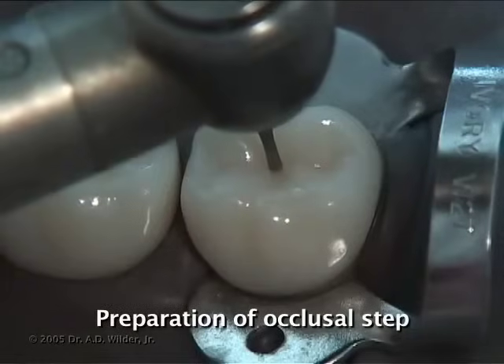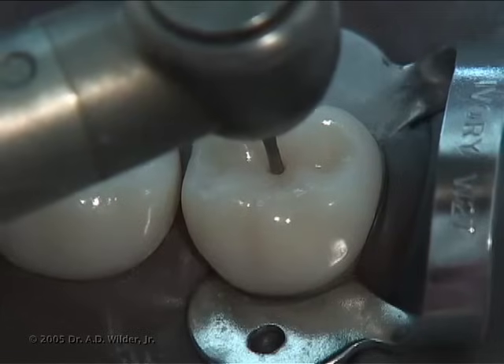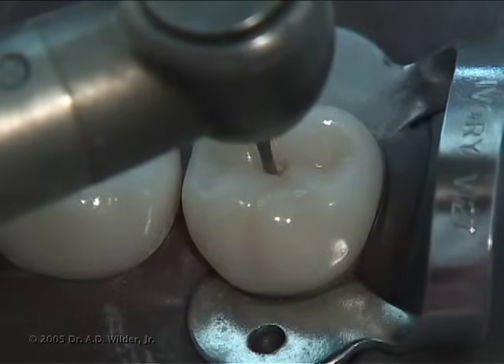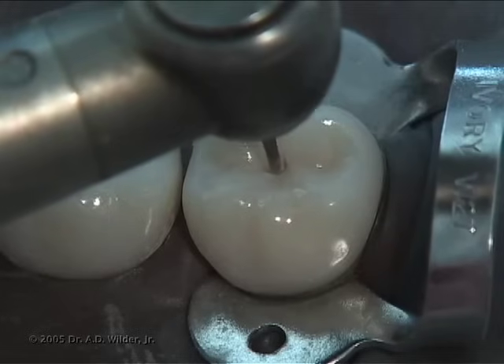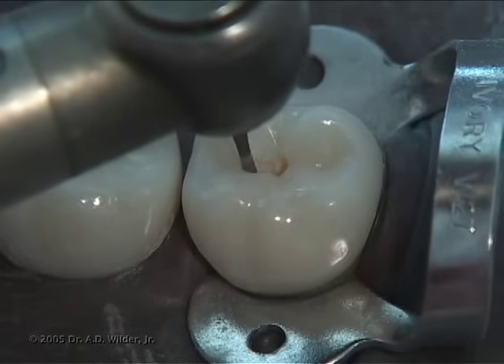After anesthesia and isolation, use a burr and a high-speed handpiece to create the initial punch cut where the caries is most involved. A good guideline is to drop somewhere between half and full length of a 245 burr, which is just shy of 3 millimeters in length, putting you just inside the dentin layer.